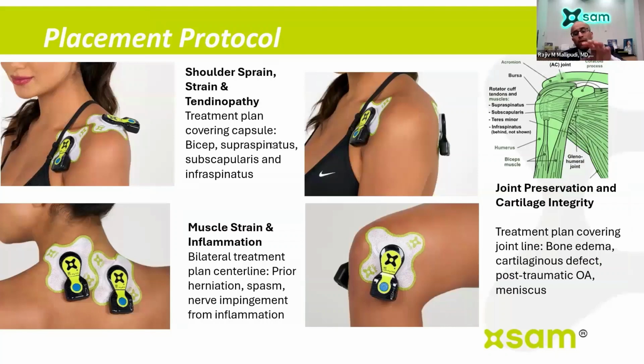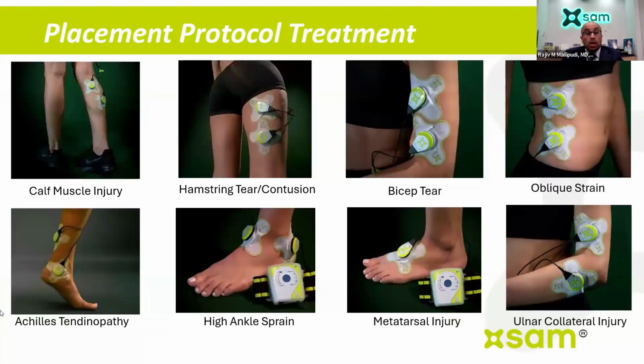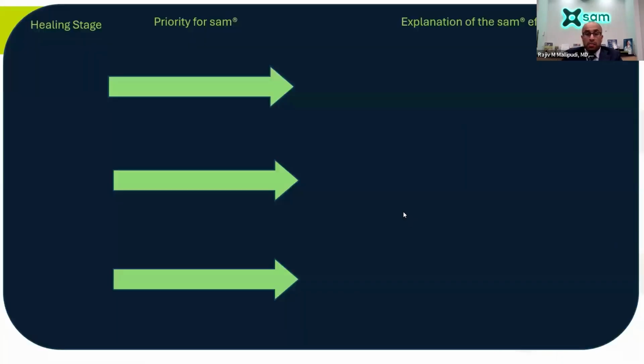You can also see how the device is placed in these slides. You typically place the devices, if they're next to each other, about 2 inches apart. If it's going to be in a capsule area, such as the shoulder, you usually have it penetrate from the front and back if possible, but you want to get a nice larger area, the size of a grapefruit if possible. This way you get that deep penetration and treat that entire tissue area as well. You can also see it applied in different areas such as the hamstring, the biceps, on your abs, or your obliques, ankles, all these various different areas that we've mentioned before.